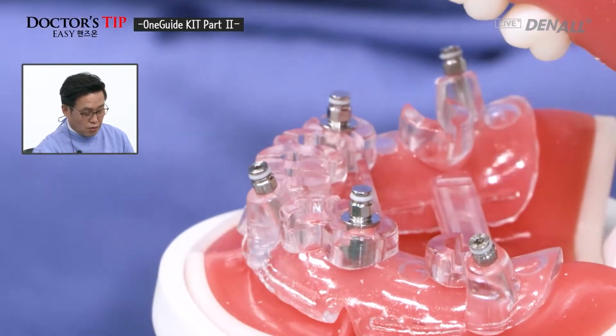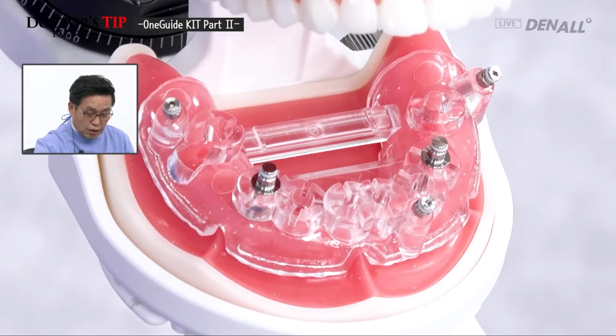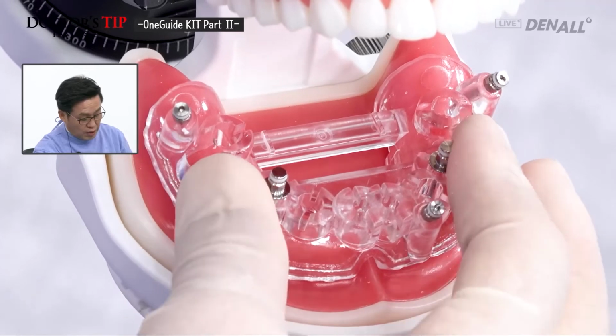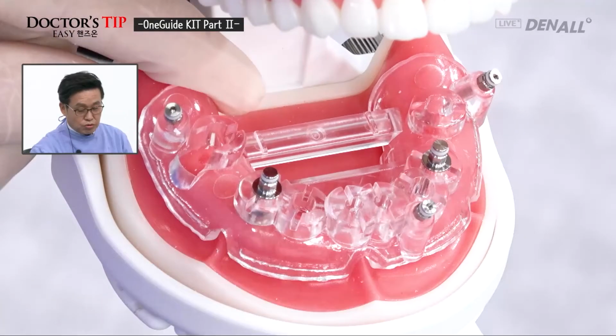This is thoroughly done. OneGuide template is in the desired position accurately. It's fully connected and is not moving.